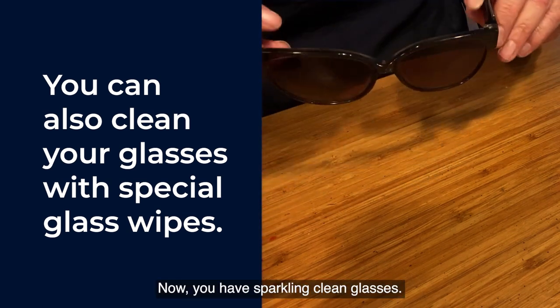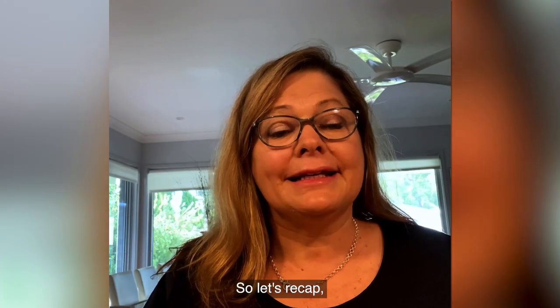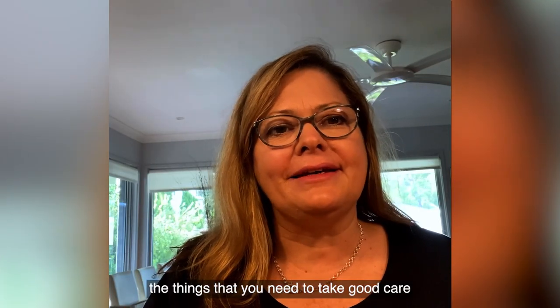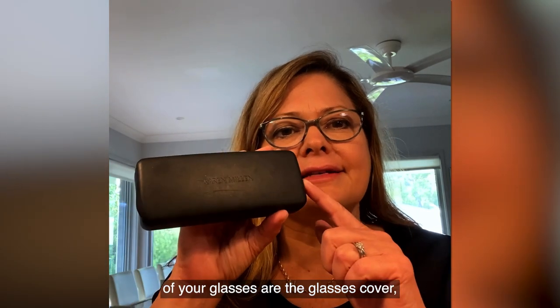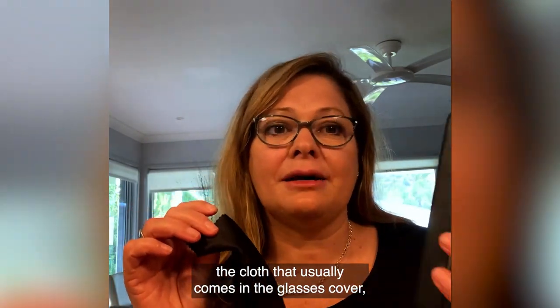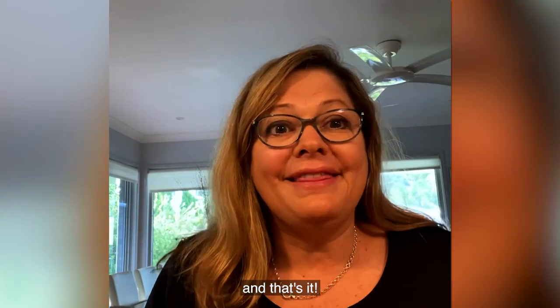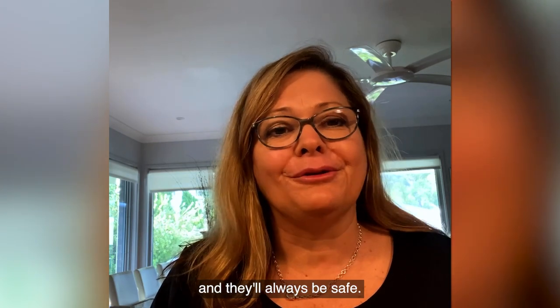Now you have sparkling clean glasses. So let's recap. The things that you need to take good care of your glasses are the glasses case, cleaner for your glasses, and the cloth that usually comes in the glasses case. And that's it — put them back when you finish with them, and they'll always be safe.